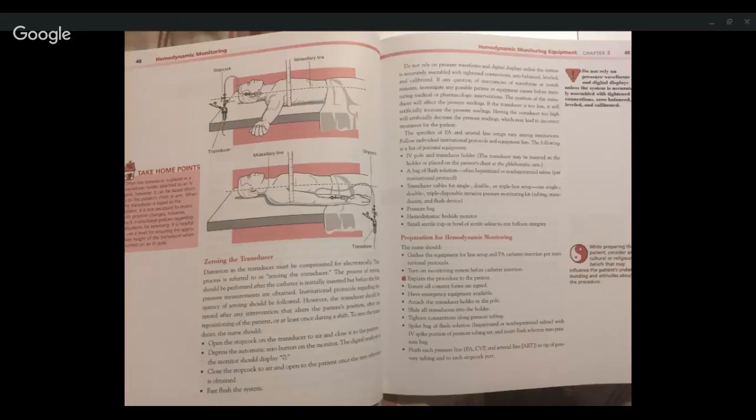The position of the transducer will affect the pressure readings. If the transducer is too low, it will artificially increase the pressure readings. Having the transducer too high will artificially decrease the pressure readings, which may lead to incorrect treatment for the patient.